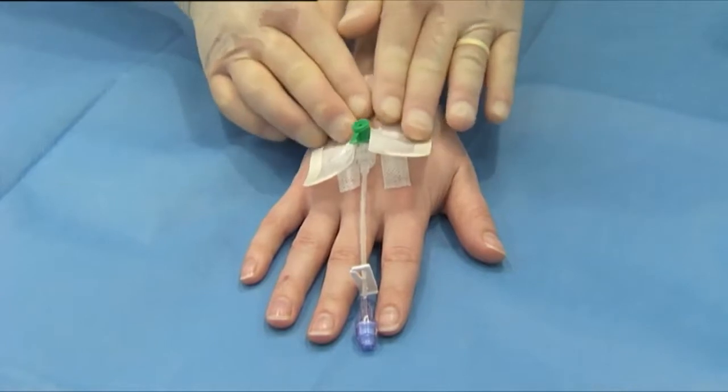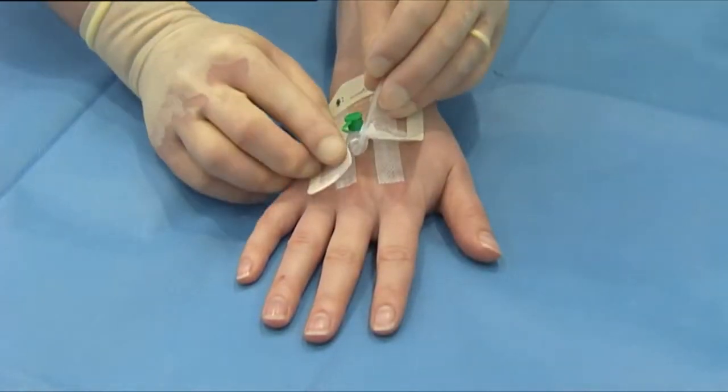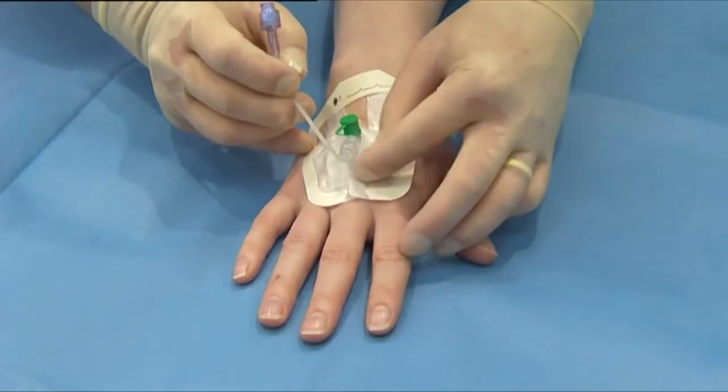Position the soft cloth tape section over the catheter wings with the port at the end of the deep notch. Overlap each side of the soft cloth tape underneath the port hub.